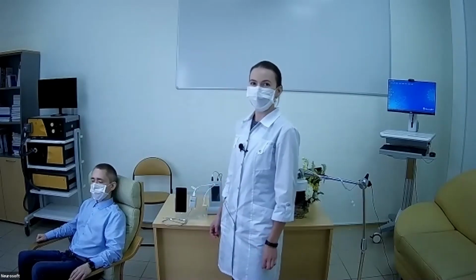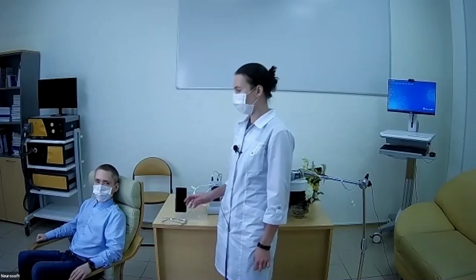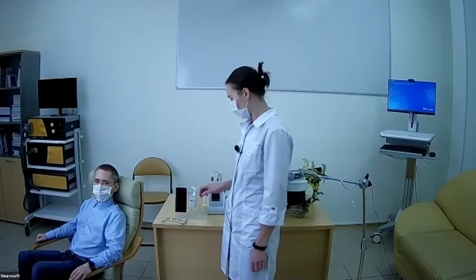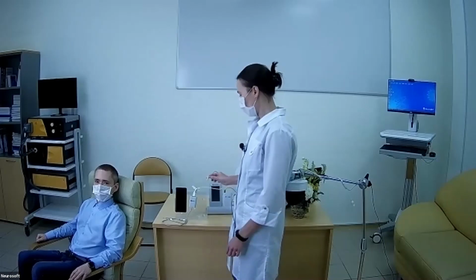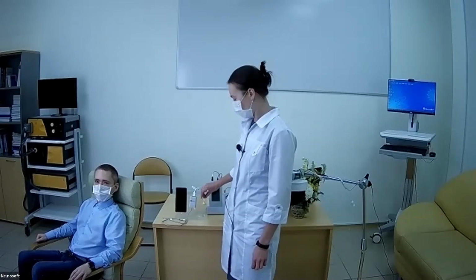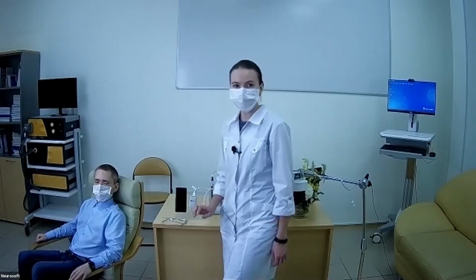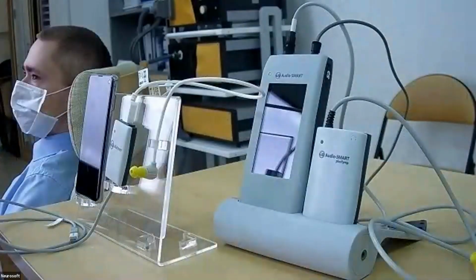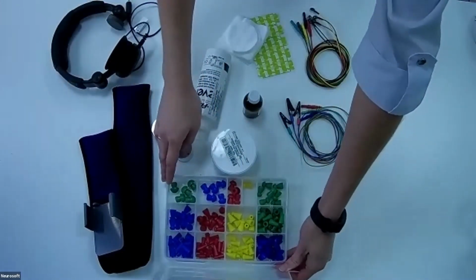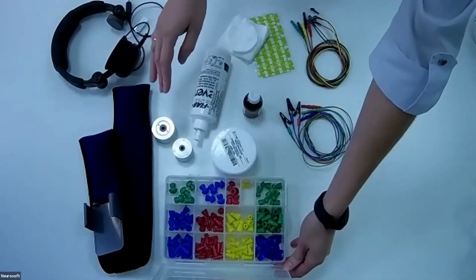Before we start, we need to look at the patient's outer ear canal and check if there are any contraindications to putting the probe in the outer ear canal. After that, we need to choose the proper size of the probe tip. You know that we have a lot of different sizes and shapes of probe tips.